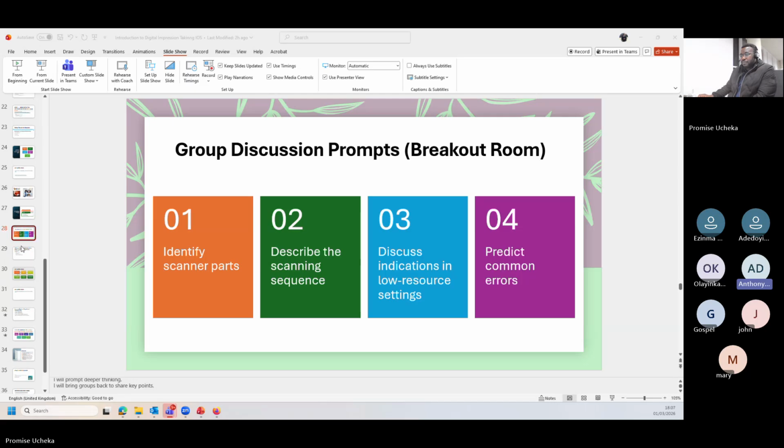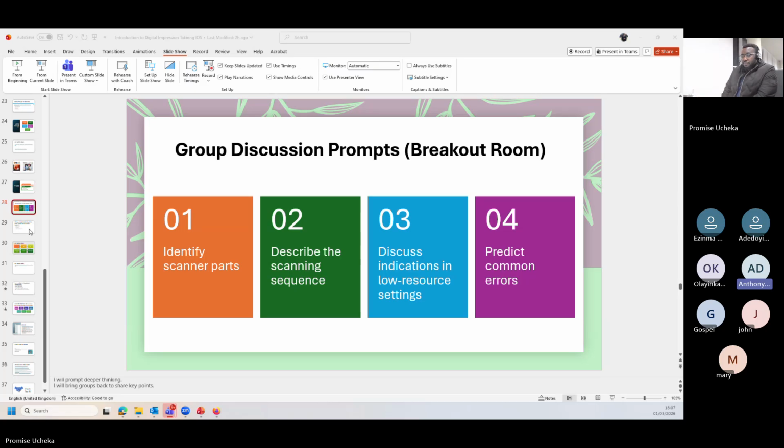Like I said earlier, if you are finished taking the upper part, you disconnect and turn to get the lower part instead of turning the full hand of the intraoral camera. Then the last one is the software interface where you connect to the laptop or to the screen or to the monitor, where you can adjust later. So that is a part of the intraoral camera. Thank you. Thank you so much.